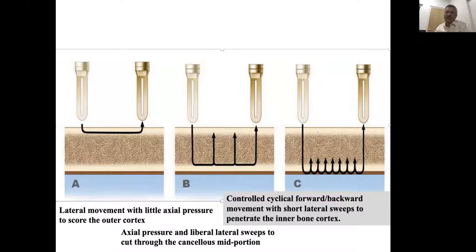Once you have weakened the inner cortex, rather than going through and through, you can put an osteotome inside that gap, and gently by rotating, it tends to break. That's a way to prevent a dural tear, especially in situations when it is significantly adherent.